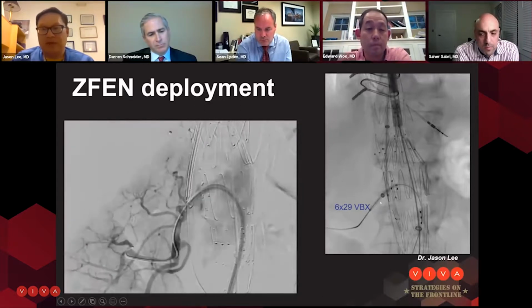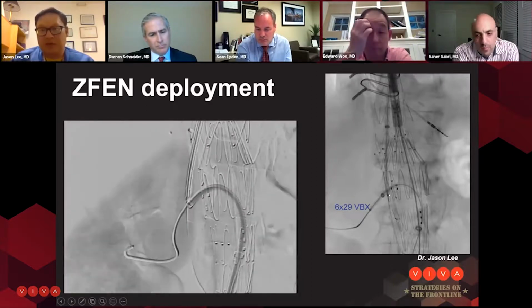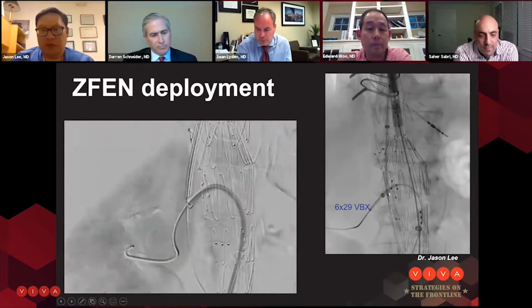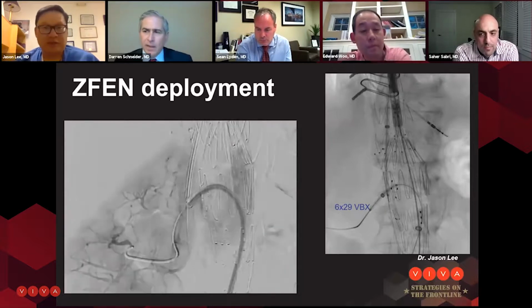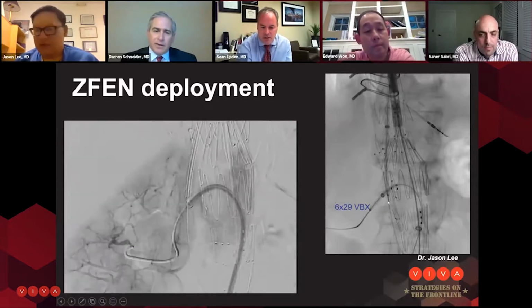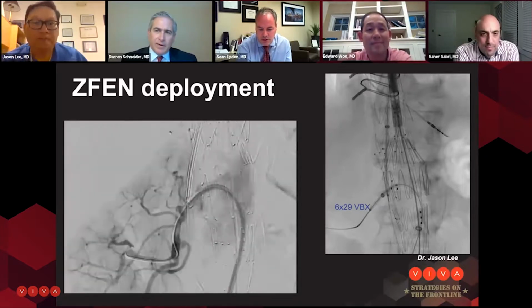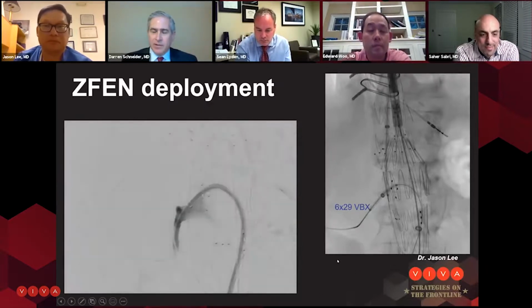Curious on the panel, I know there's always been a lot of chatter between using iCast and, if there were Europeans on the call, a lot of Bentley grafts. We've switched pretty much to using VBX for all our fenestrated branches. There's been some controversy about it having discontinuous rings. Just curious what the panel thinks about VBX versus iCast versus, if you were European, a Bentley for a fenestrated branch. I use both iCast and VBX, although I still have concerns about VBX because of those independent rings.